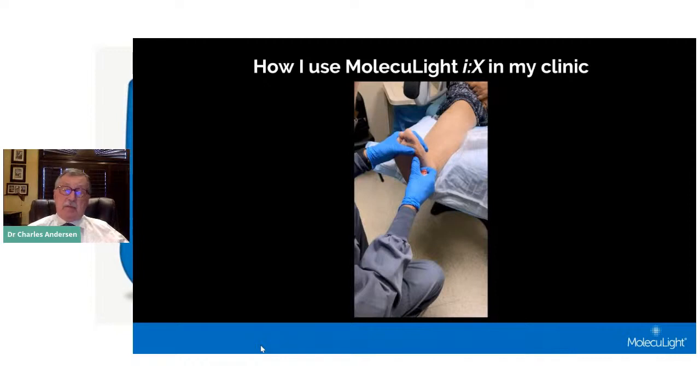Today in clinic, a very good example, we had planned on using a fairly expensive biologic tissue. We scanned the patient. Not only was there significant bacterial burden within the wound, but just like the case that I demonstrated a few minutes ago, there was significant bacteria in the tissue around that wound. So we aborted the use of that biologic tissue. That patient we debrided, and we also placed on systemic antibiotics. We also changed the follow-up plan.